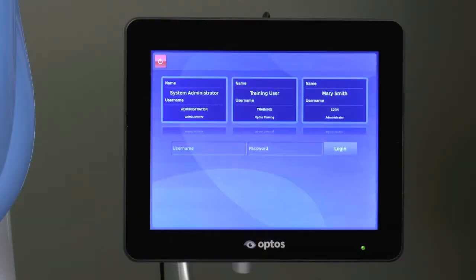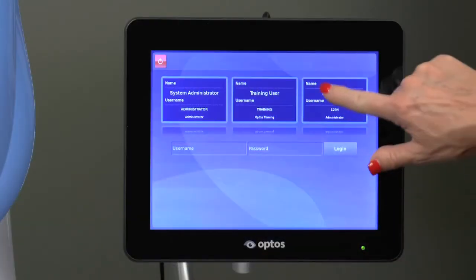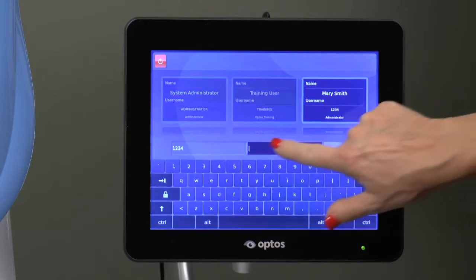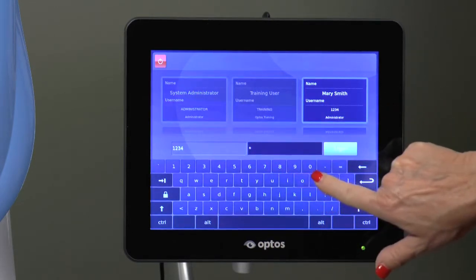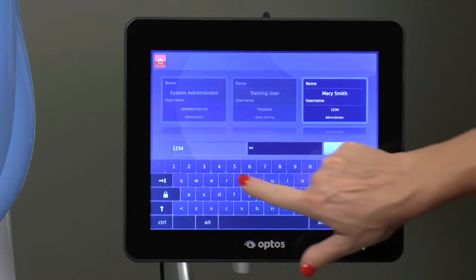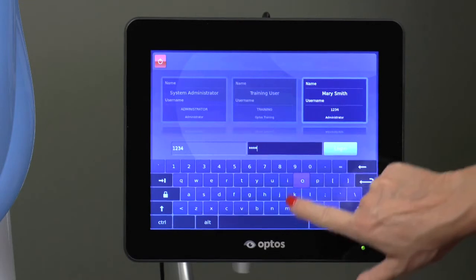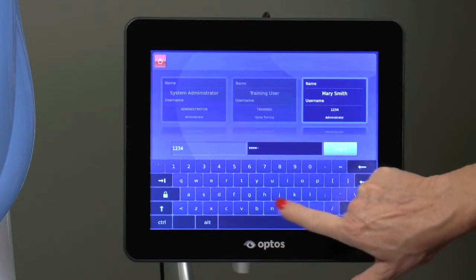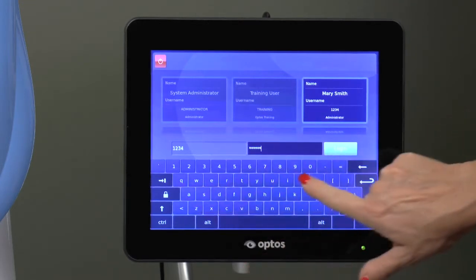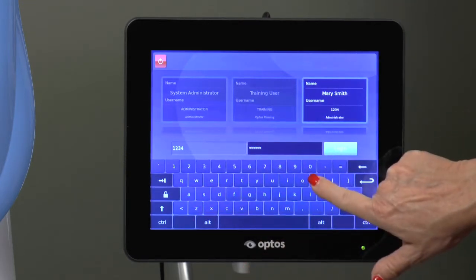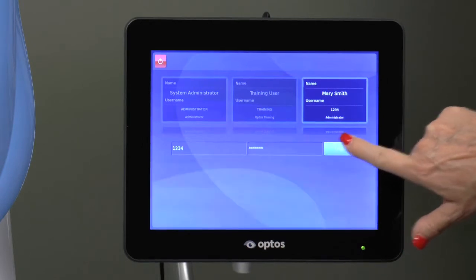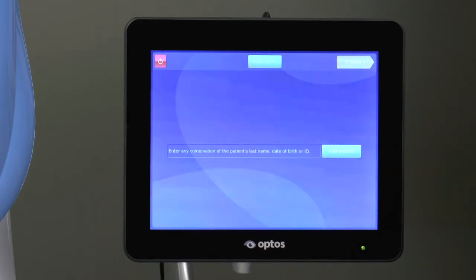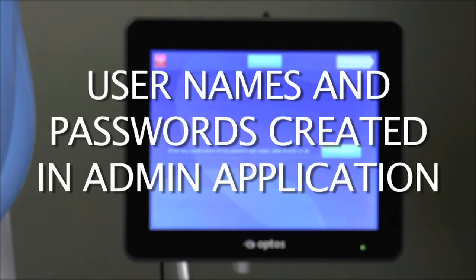To log in, choose a user by swiping through the cards at the top, or type in where it says user name. Choose the correct user, enter the password, and click log in. Please note that usernames and passwords are created in the admin application on the server.